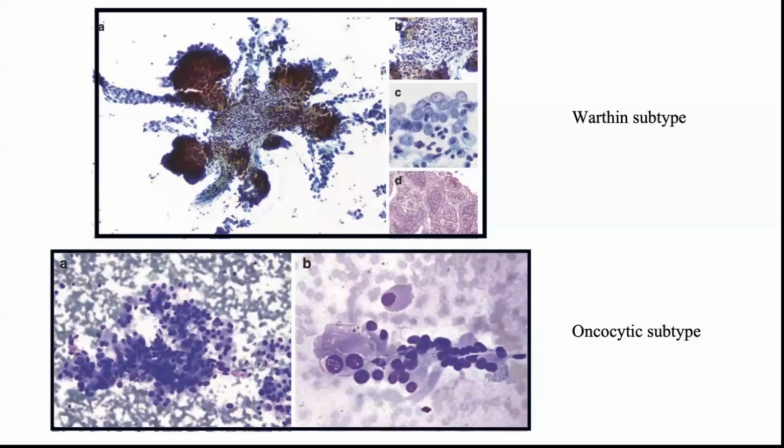They have papillary architecture with lymphoid follicles, and their characteristic feature is that they are associated with a lymphocytic background and Hashimoto thyroiditis 90% of the time. They will have abundant oncocytic cells, that is pale, eosinophilic, granular cytoplasm with nuclear features of PTC. They are rare types, present in 0.2 to 1.9% of PTCs.